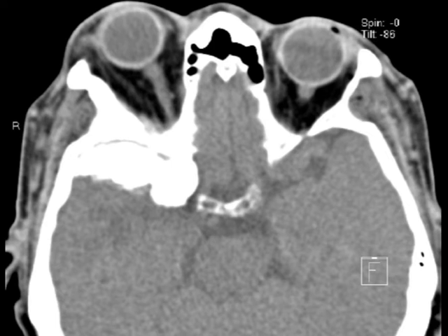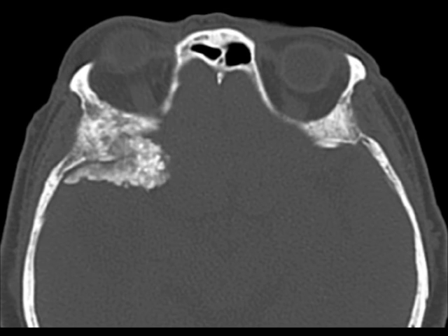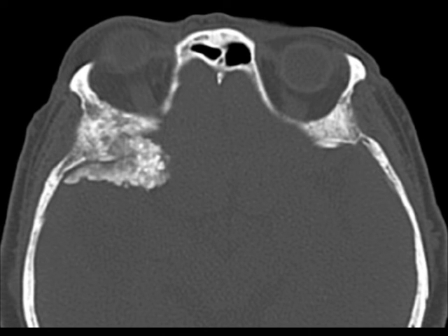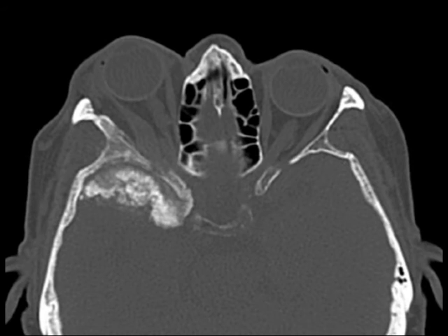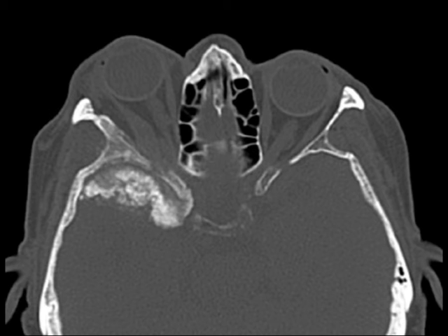These images demonstrate a hyperdense infiltrative mass located in the anterior right middle cranial fossa with impressive reactive hyperostosis involving the greater sphenoid wing with extension into the right orbital apex, skull base foramina, and right sphenoid sinus. There is hypoattenuation in the anterior right temporal lobe likely reflecting gliosis.